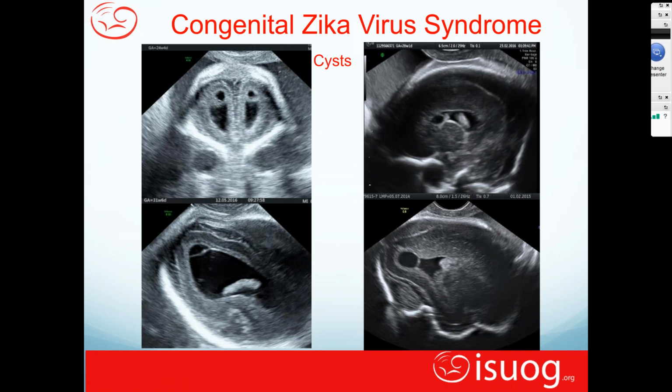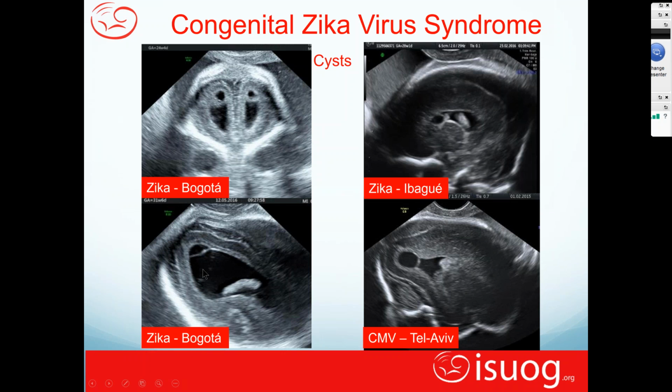Now, when we start thinking about what I have seen before in other examples of viruses, CMV is certainly one of them. You probably remember that there were cysts within the ventricular system. And here are 4 examples of cysts. I'm not going to point out just yet, but in a moment, whether these may be from a Zika case or from a CMV case. They look very similar, and I think those are the things you can think about.